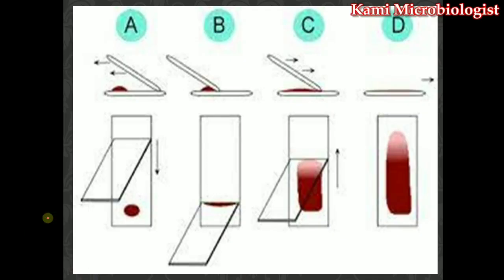Arise in our mind: how can we make the smear or blood film? We can also call it a blood film, blood smear, or peripheral blood smear as well. Now, how can we make it? First of all, we have to take one slide.